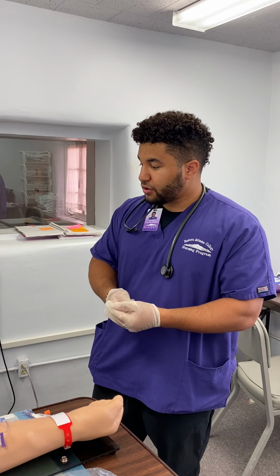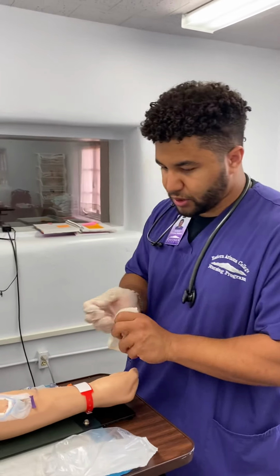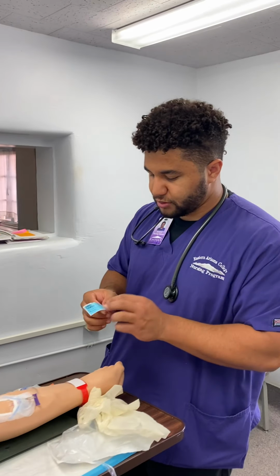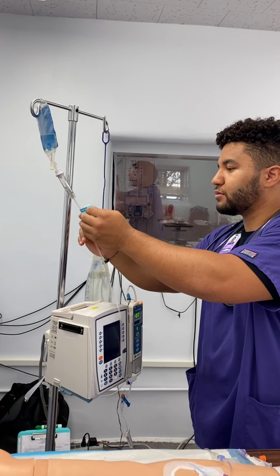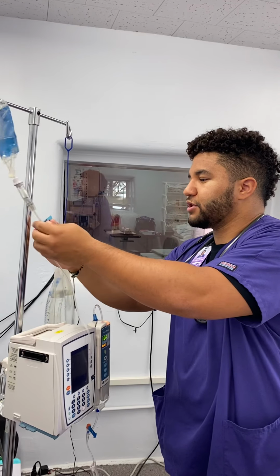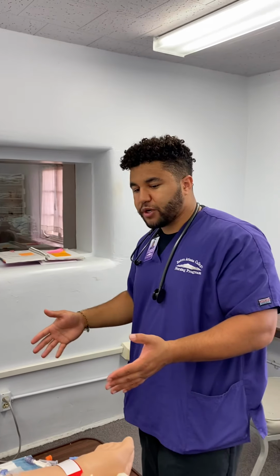If you were able to resolve the air in the line problem, you could move on to labeling your tubing. So you can come on over here and grab your tubing label, place it on your tubing, give it a date, time, and initial. There is also labeling that goes on the medication. That is a patient label that you place there. And then again, before you leave, you make sure everything's working properly, the patient's not in any pain, and everything is running smoothly. On the way out, you're going to do hand hygiene and document the fluid you hung and how the patient tolerated the procedure.